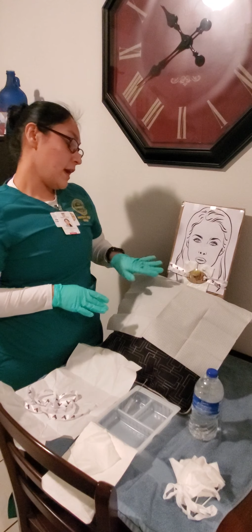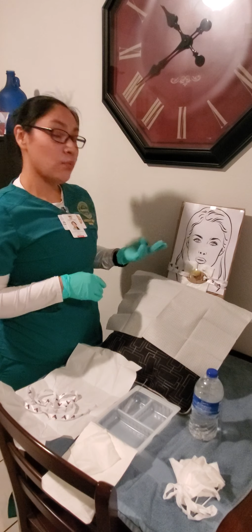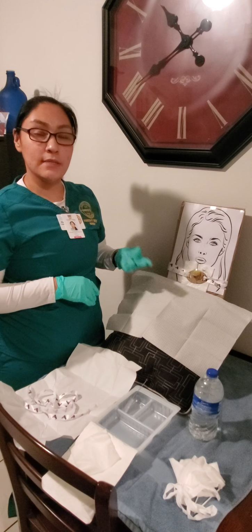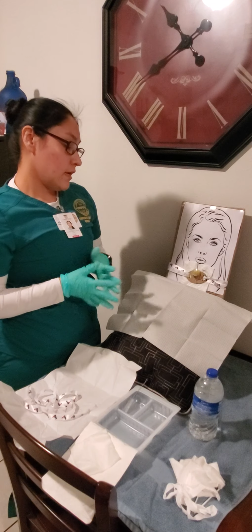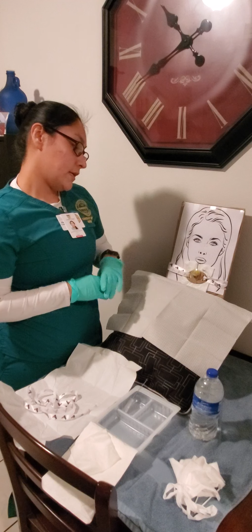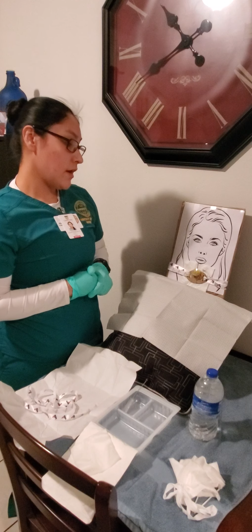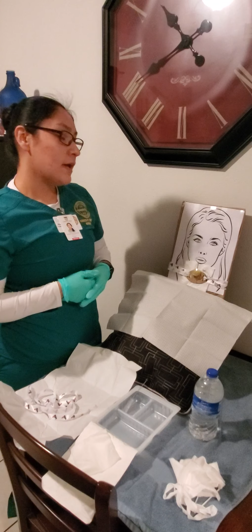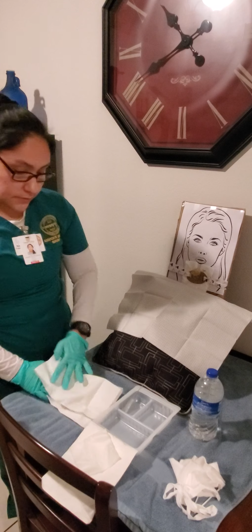Okay, once you've already placed your new tie and removed the old one, you do want to make sure that you allow one loose finger or two snug fingers between your patient's skin and the tracheal tie. After that, once you're done with tying it up, and you make sure that you check that it's either one loose or two snug fingers between there, you can just go ahead and assess your patient, make sure that your patient isn't having trouble breathing, and if they're not, you can just go ahead and dispose of your materials.